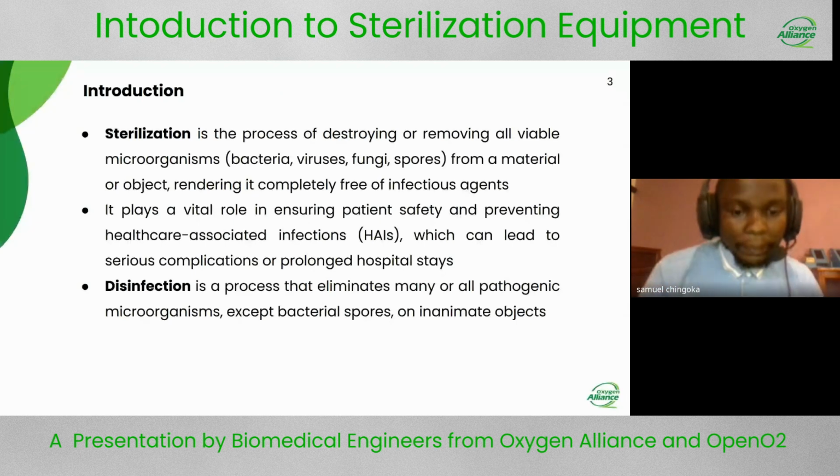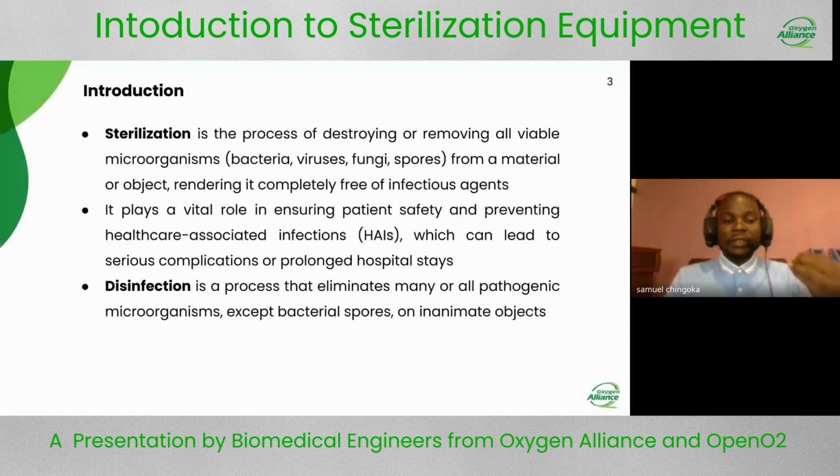because there are some things, for example the spores, which are structures that bacteria have on themselves to protect themselves. These spores are very resistant to heat or some chemicals. So that's what disinfection does.